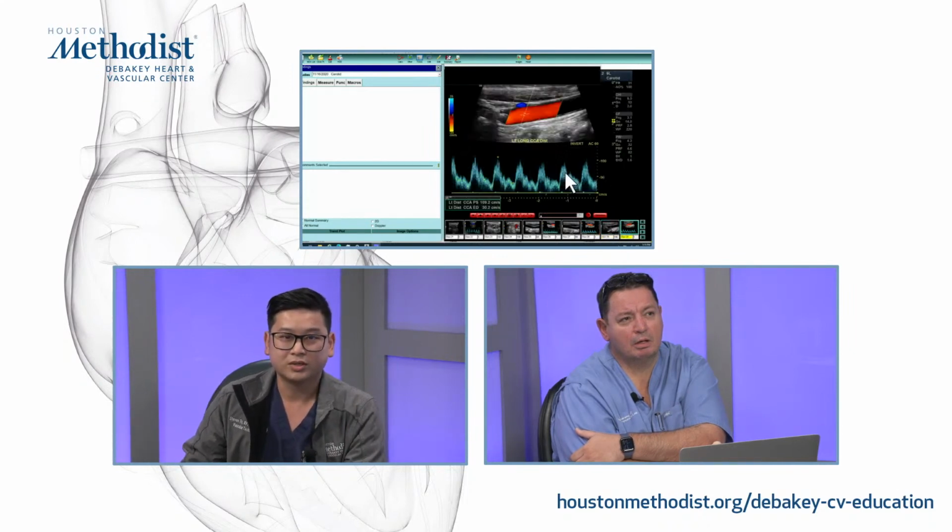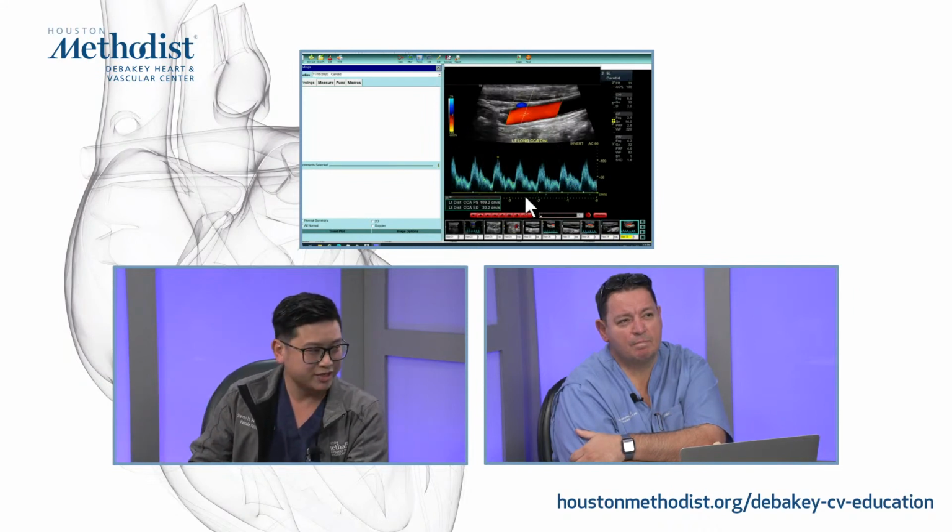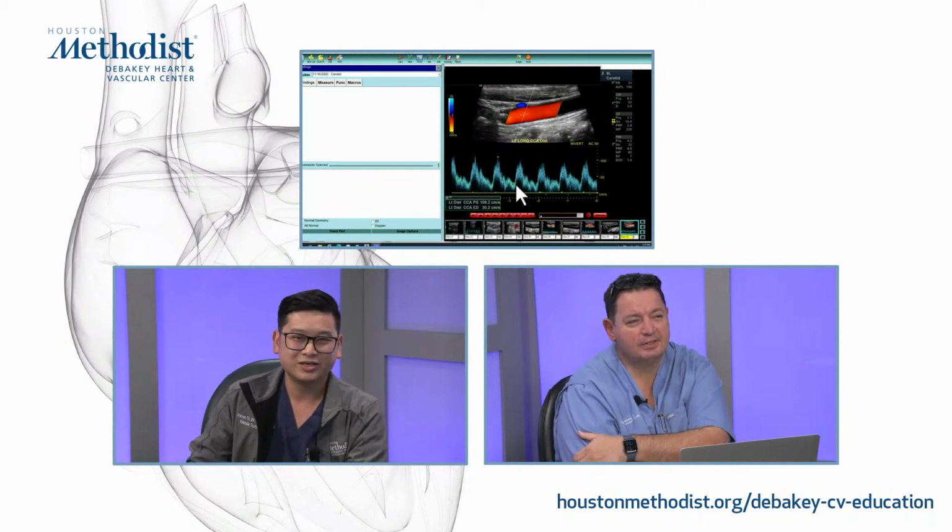All right. Distal. Waveform is constantly kind of changing, getting, would you say, a healthier waveform? Yeah, would you say lower resistances, I guess. You're seeing more characteristics on it.